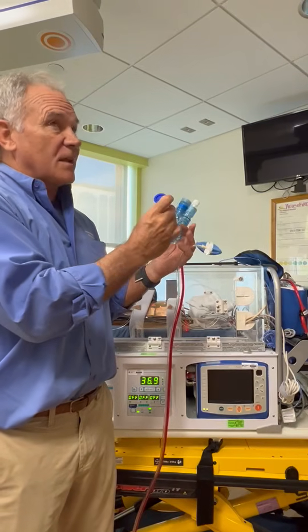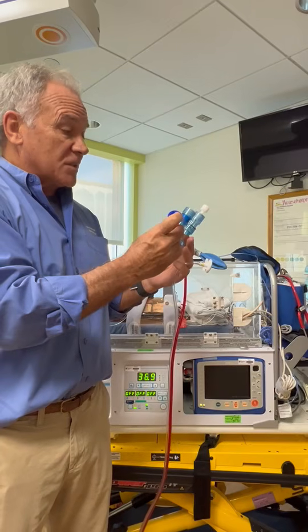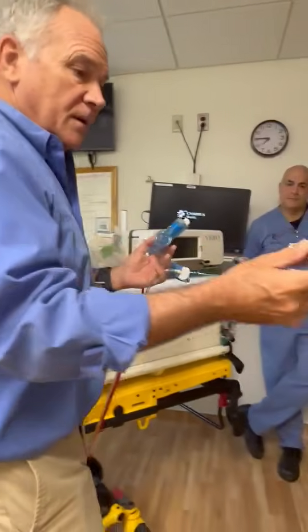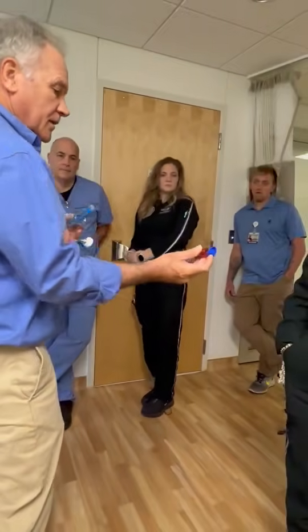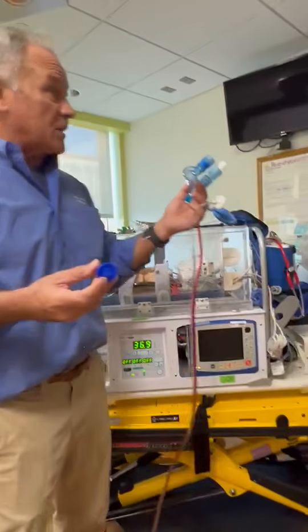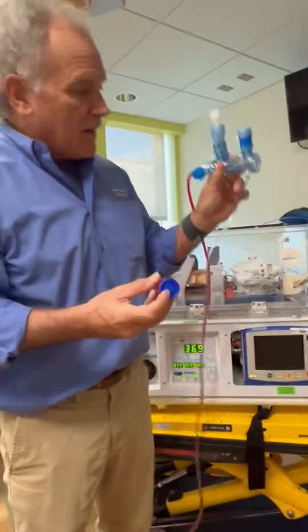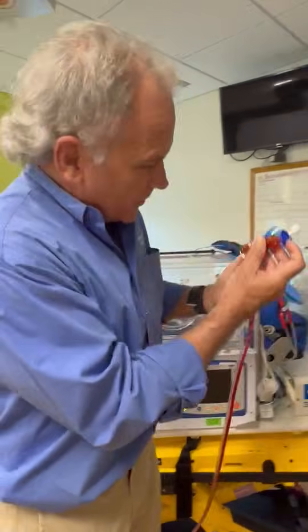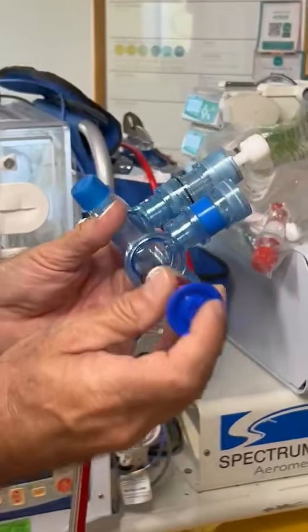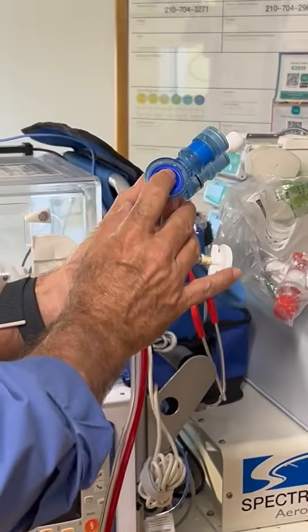But it's different. This is classified as a flow interrupter. Okay. So the gist of it is, I don't know if you can see, it's got this little mini diaphragm here, and it's got a spring. See that little spring right here? It's got that little donut gasket. The flow interrupter was actually the first high frequency ventilator, developed out in California. But anyway, the way it works, if you look inside the phasitron, there's a little seal. So when this goes in, this little donut gasket goes down here and it seals everything off. It just stops. So that's the inspiratory side.